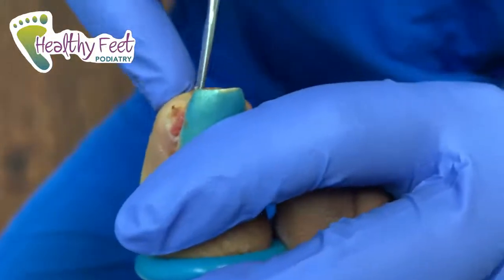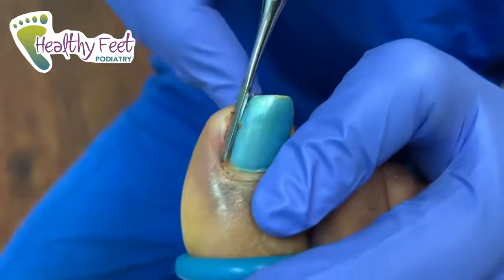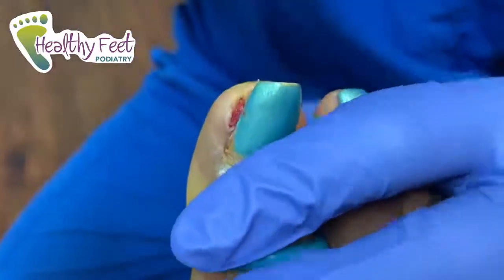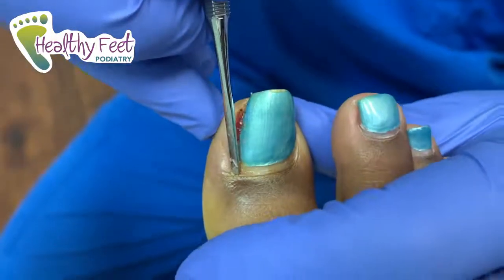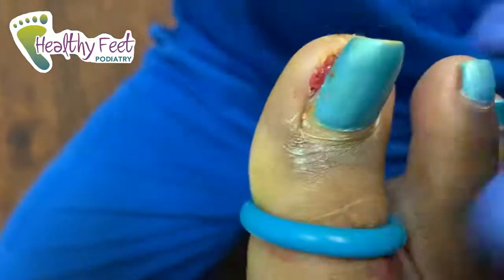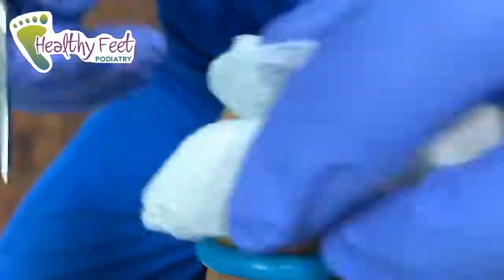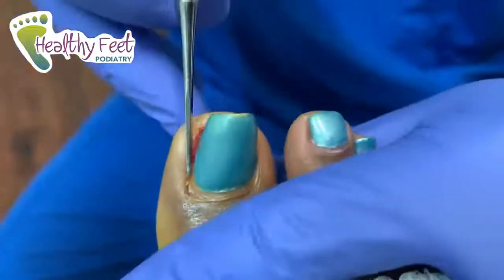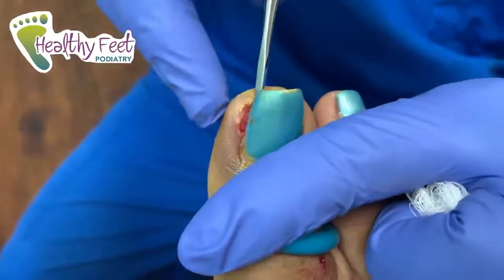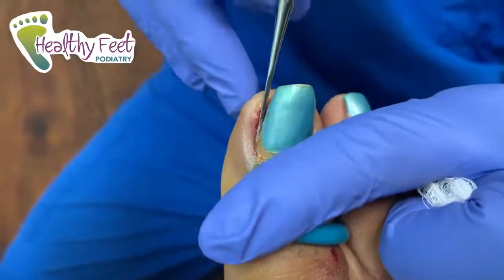So we're gonna free this up. Our goal is to get this corner out where it bends down into the skin. And remember, we got to keep it sexy. So she was telling me earlier how she may or may not have gotten it from a pedicure. All right, pedicures aren't bad. You just got to go to the right place.